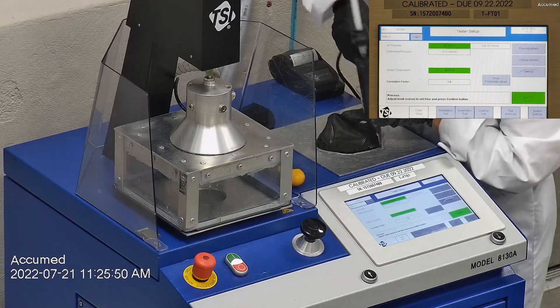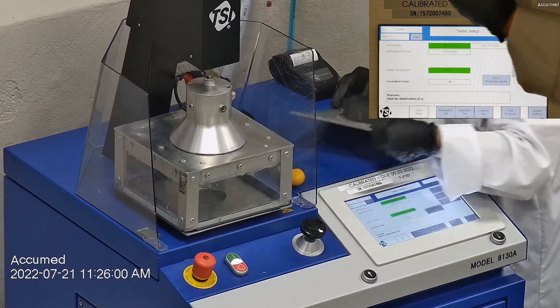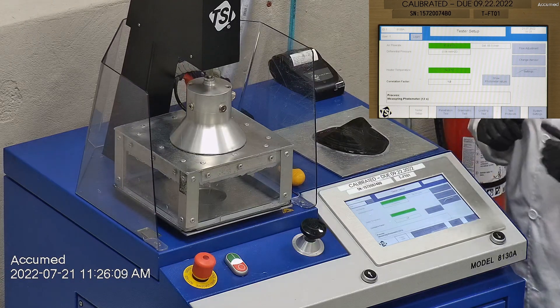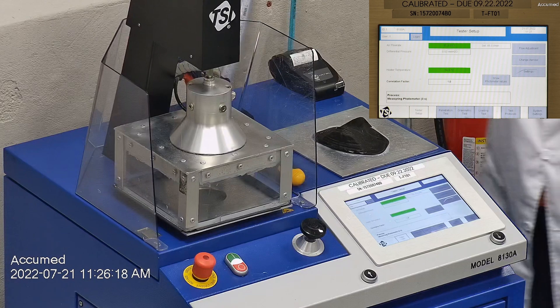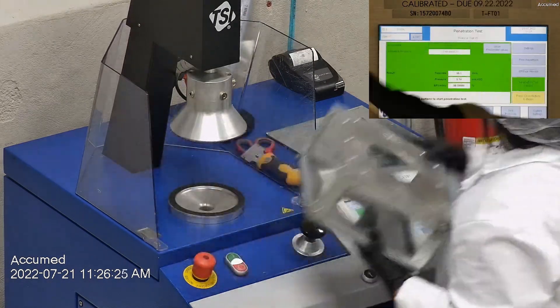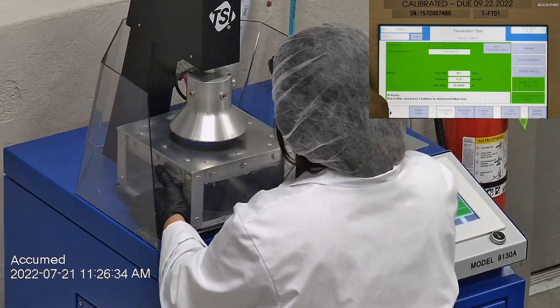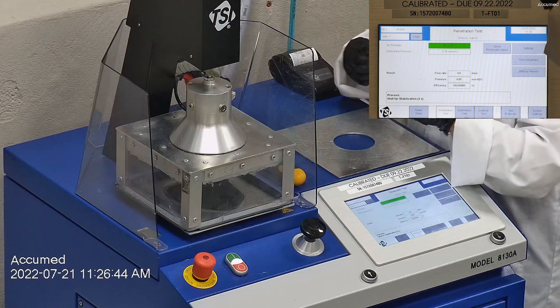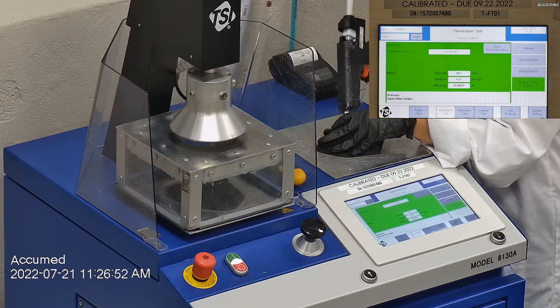The testing plate is attached to the frame and the box is placed under the TSI filter holder for testing. The results are displayed on the TSI monitor: F stands for air flow rate, which we test at 85 liters per minute; R is for resistance, also referred to as pressure drop, which correlates with breathability — the lower the number, the more breathable the mask is; and E stands for filtration efficiency percentage.